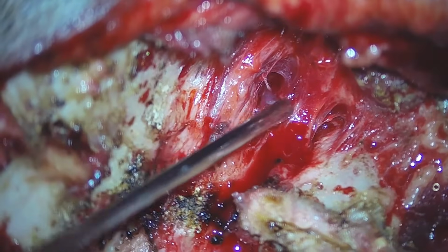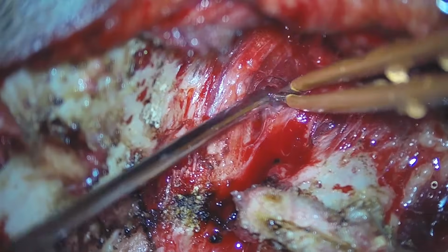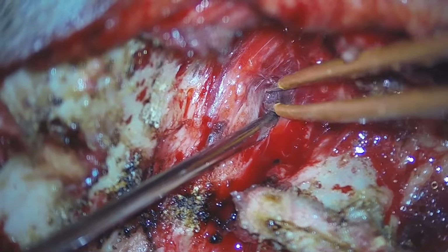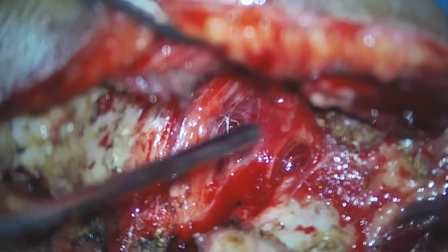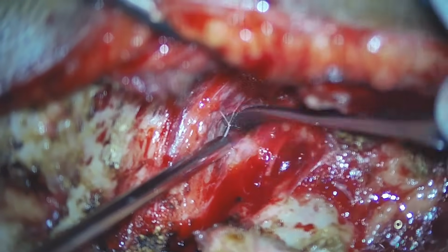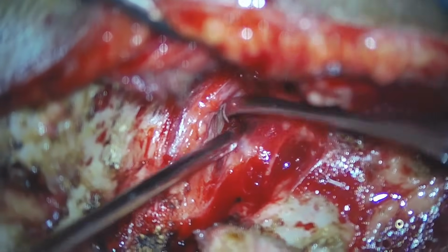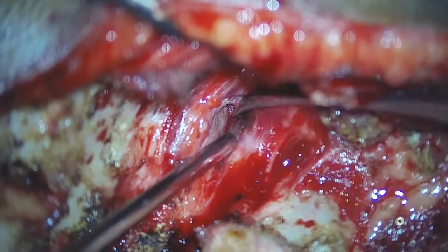This is exposed. Here, the venous plexus are more around the C2 ganglion. Careful hemostasis and packing the C2 venous plexus near the C2 ganglion is done, and switching technique is done. After doing on the right side, we will switch to the left side, exposing the C1 posterior arch and the attachment of posterior arch to the lateral mass.